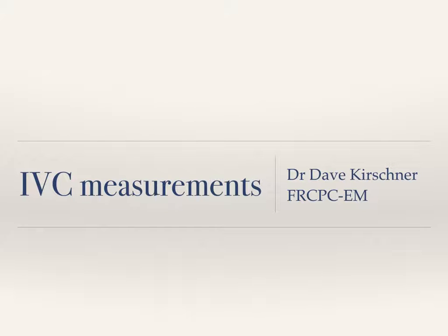Now, the reason this comes up is because we can ask ourselves, well, why do we measure the IVC where we do? I was teaching a course a couple weeks ago with some colleagues, and this came up as a question in one of the sessions, and it was shown nicely by one of the patients that we were scanning. And so to begin with, I'd like to just go through the patient's views that we had looked at.